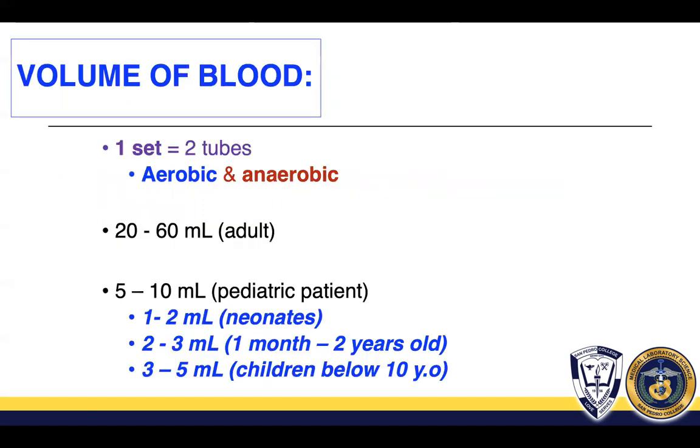Okay, so moving on to volume of blood. Remember that the volume of blood obtained for each blood culture set is the most significant variable in recovering microorganisms from patients with bloodstream infections.